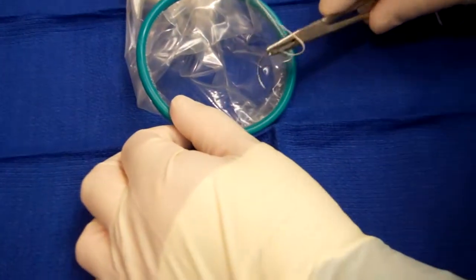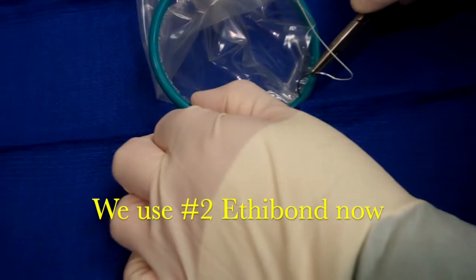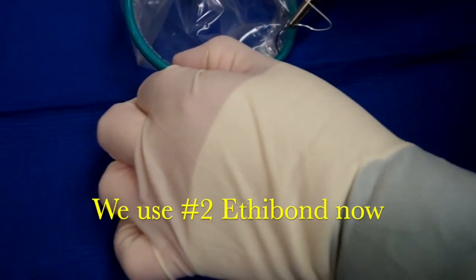Okay, so we're gonna make a tether. This is the Alexis small. And we're gonna do a figure of eight with a one on a CT1. So Brenda's gonna come right through there. And she's gonna rotate that.